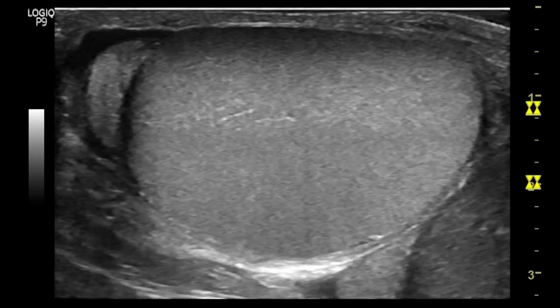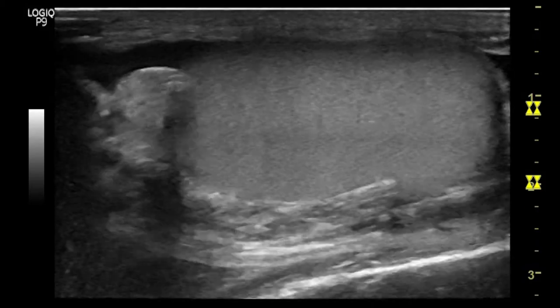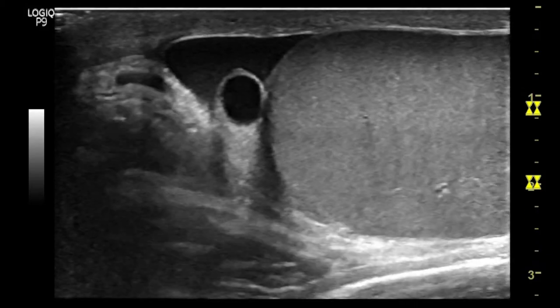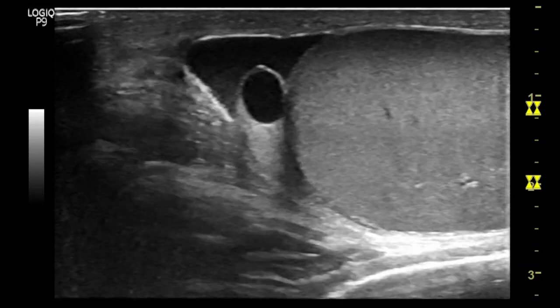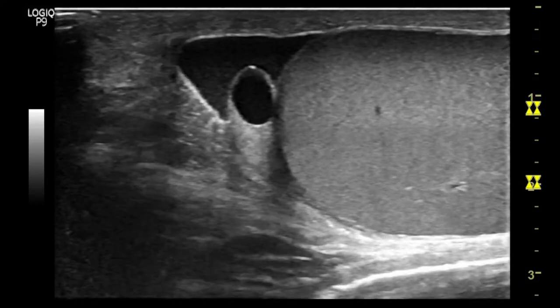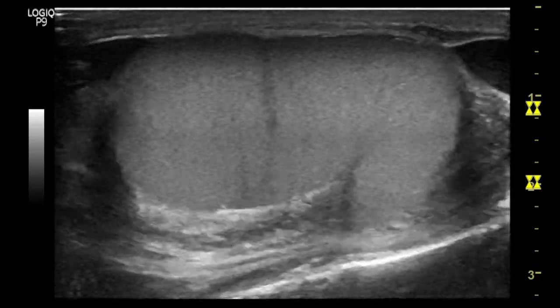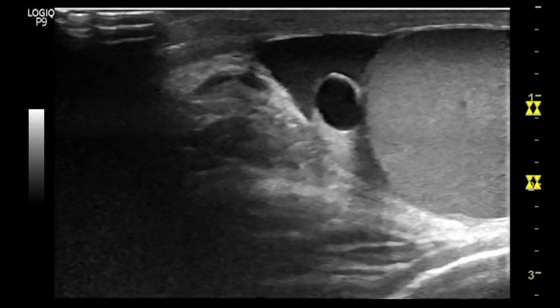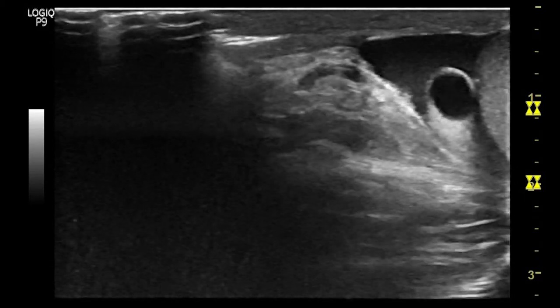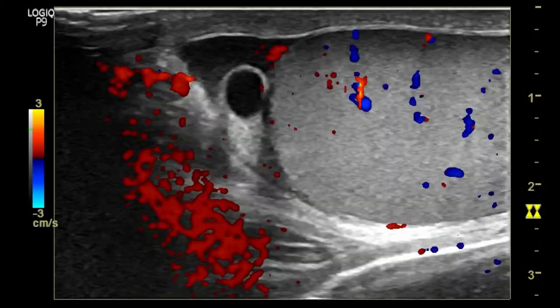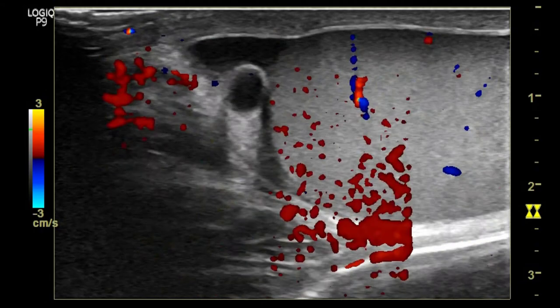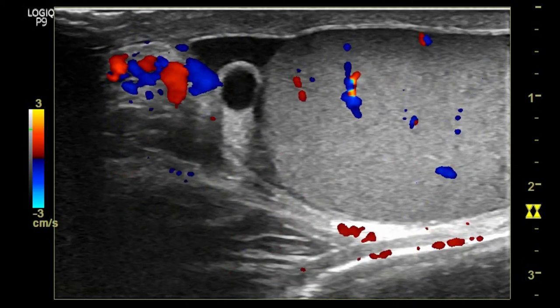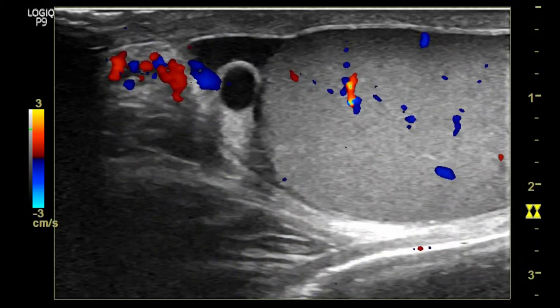On real-time, you can see the normal testes. A small anechoic structure at the head of the epididymis is noted. You can also see some collection around the testes. Color Doppler shows no abnormal vascularity within the testes or epididymis.